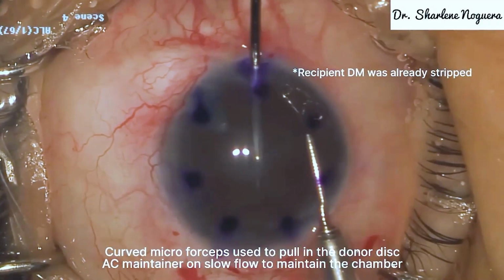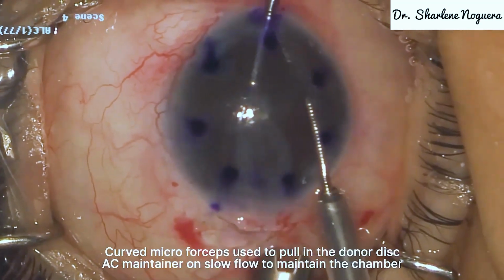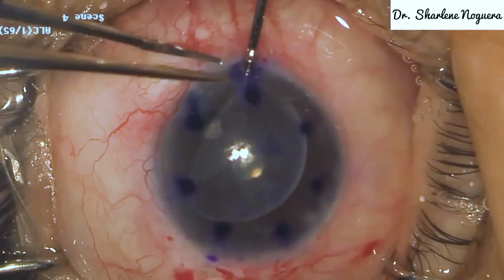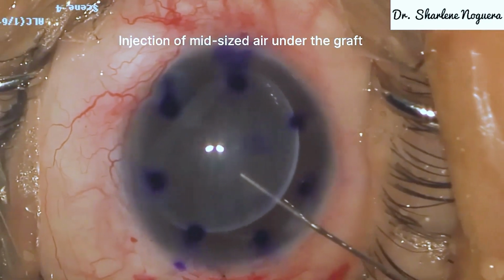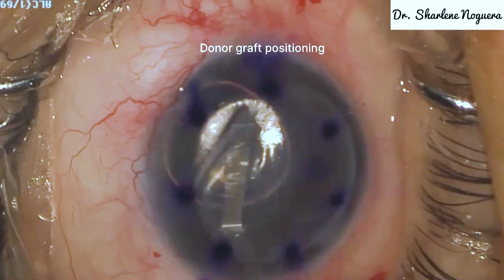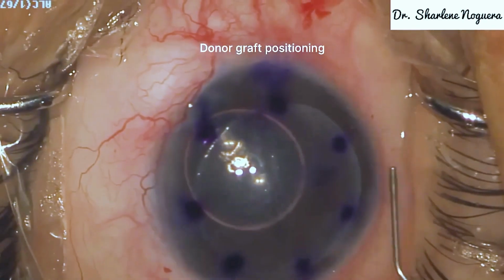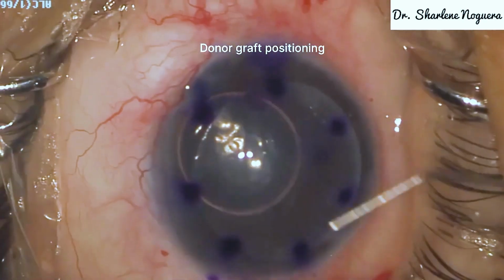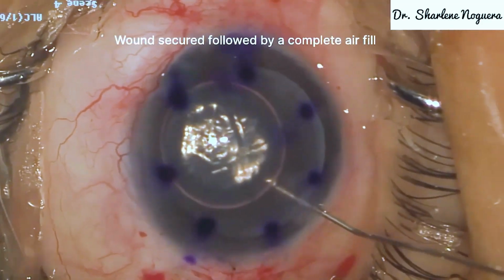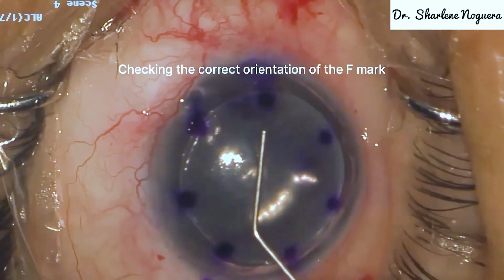A curved microforceps was used to pull in the donor disc, with an AC maintainer on slow flow to maintain the chamber, pulling the disc gently, and it unfolds automatically. Injection of a mid-sized air bubble under the graft was done with the donor graft positioning. The wound was then secured, followed by a complete air fill. Lastly, check the correct orientation of the F mark.